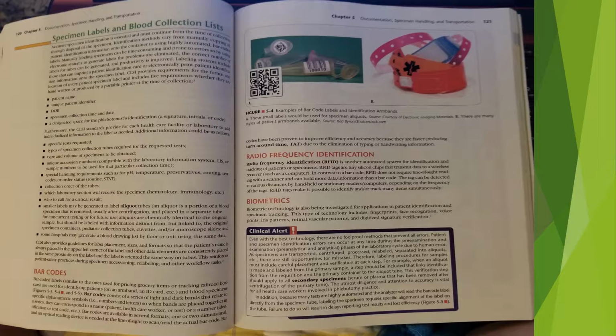CLSI provides requirements for the format and location of every patient specimen label and include 5 requirements whether they are handwritten or produced by portable printer at the time of collection. The 5 requirements are patient name, unique patient identifier, date of birth, specimen collection time and date, a designated space for the phlebotomist identification, a signature, initials, or code. Furthermore, the CLSI standards provide for each healthcare facility or laboratory to add individualized information to the label as needed.